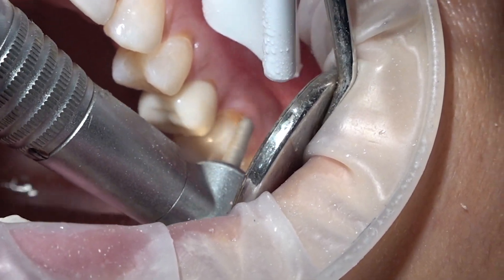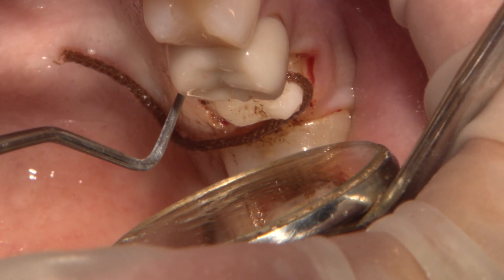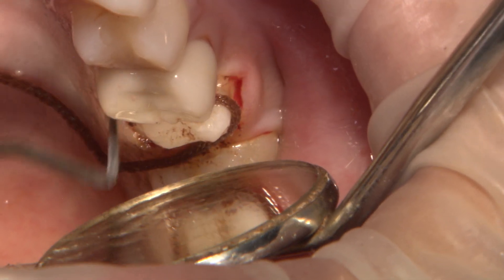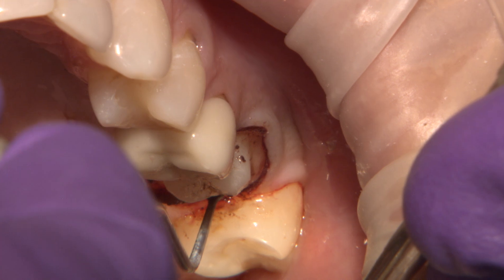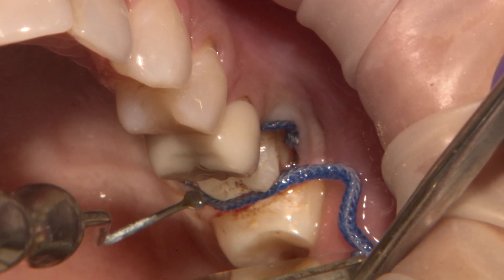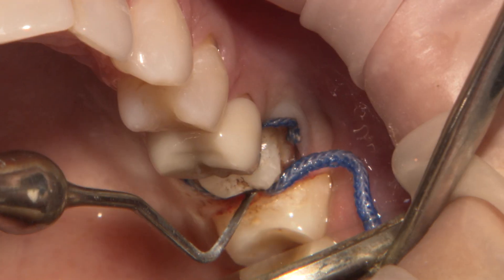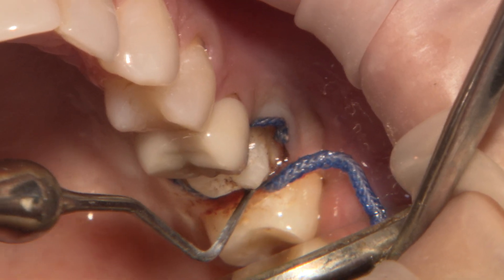I prefer the two-cord technique. First cord is for compression — a size 0 is placed in the sulcus to control moisture and positioned apically to the gingiva. The second cord is for deflection: a larger hemodent-soaked cord is placed to deflect tissue laterally away from the tooth.